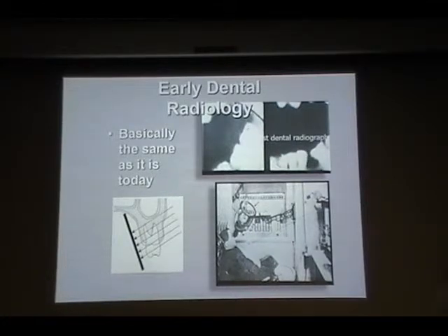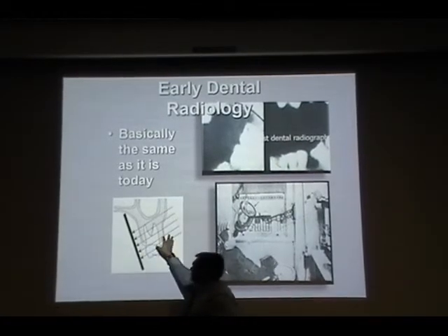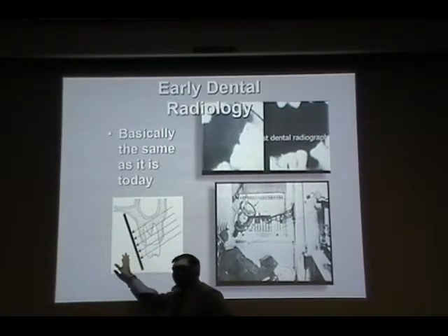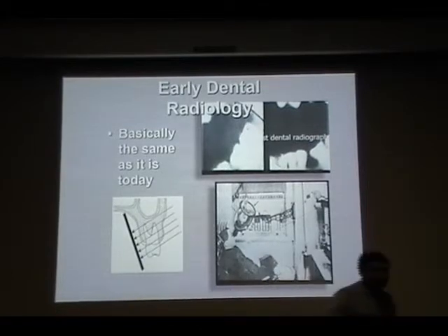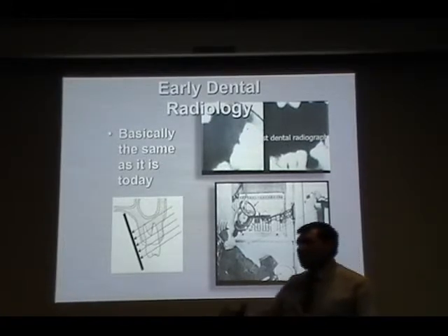The only thing that has changed here, as I was telling Brian, is that X-rays are released onto the object, and the receptor is the only thing that has changed. For instance, we started off with films, from A all the way to letter F. That's where we stopped.